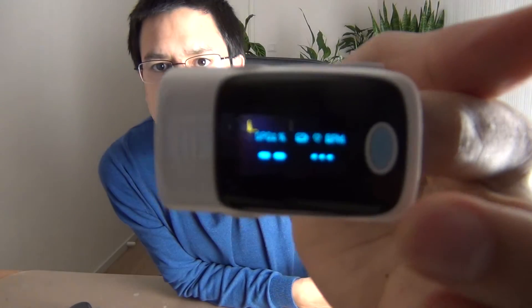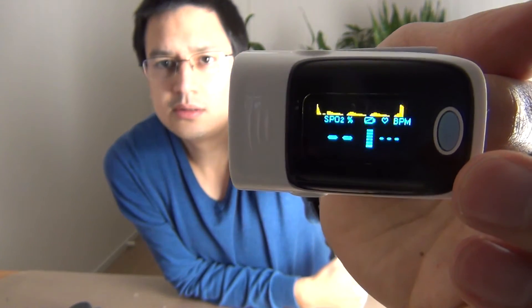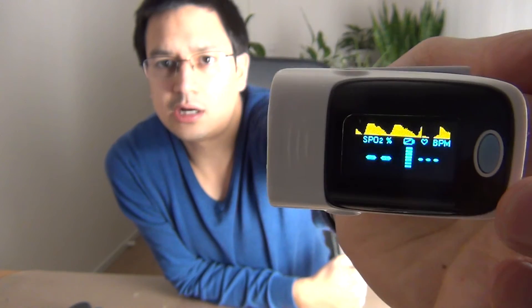If you're not quick enough it will auto shut down, so I have to re-enable it now. I'm going to do the measurement now and you can see what's on the screen. During the heartbeat measurement you should not move too much with your finger because it interferes with the readings.